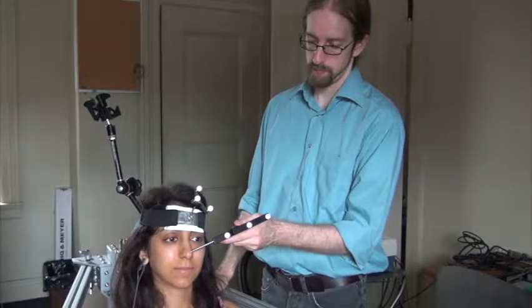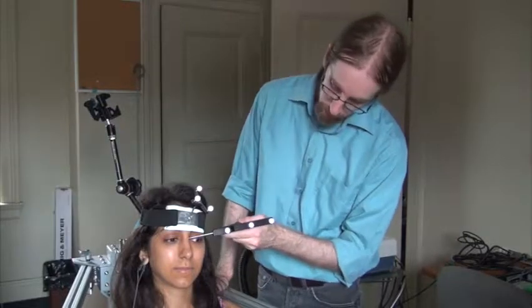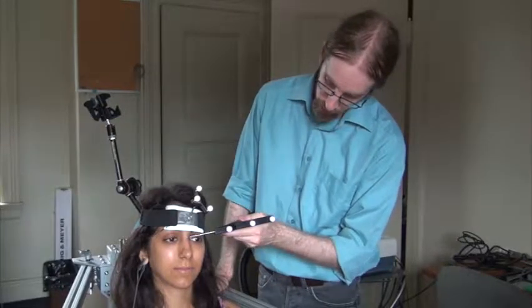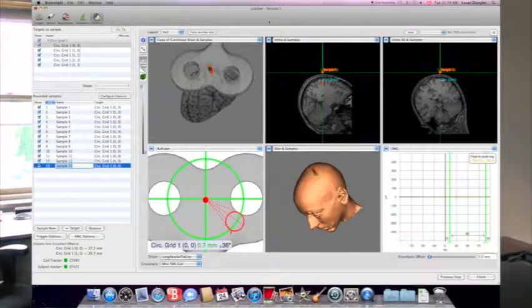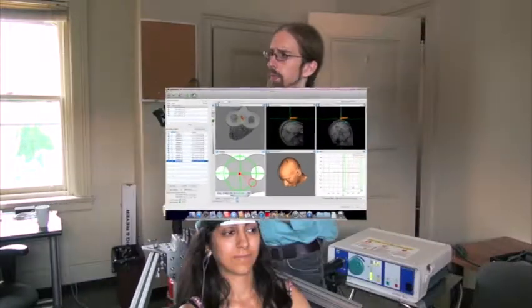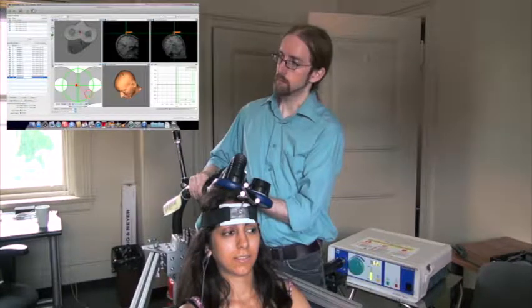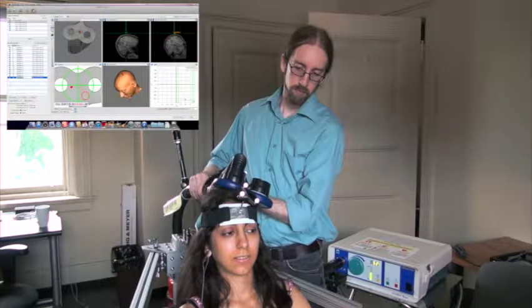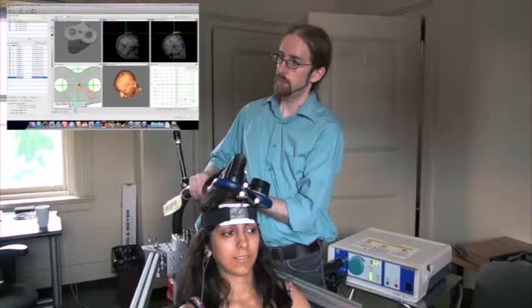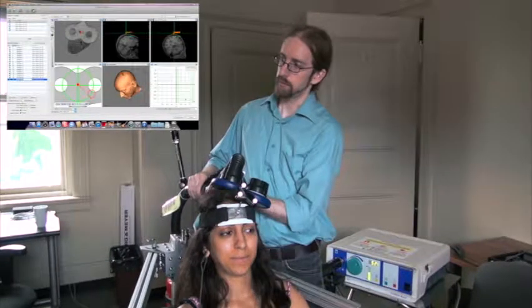Specific spots on the participant's head, such as the nose tip and bridge, are registered to the corresponding spots in the 3D model used by the mapping software. Following this registration, infrared sensors located on the coil and on the headband worn by the participant allow for positioning of the coil relative to the participant's brain.